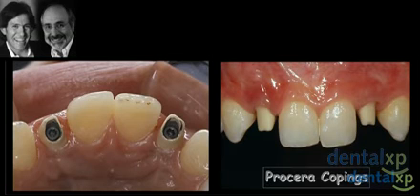That's another option. Vertical and kind of funneling it out a little? David, what David has shown me to do over the last few years is that you can go in here with these beaver blades or ophthalmological blades going into the sulcus, not raising the papilla, not coming in from the horizontal approach, but actually going in vertically underneath the sulcus with a sharp dissection with a microsurgical blade and going up beyond the mucogingival junction, creating your tunnel, and then slipping the tissue in on the facial aspect.